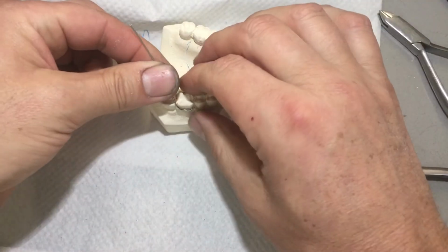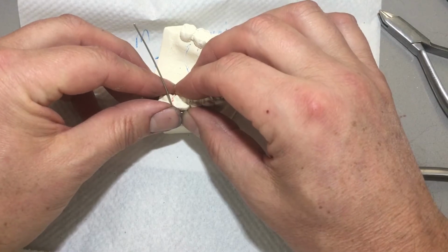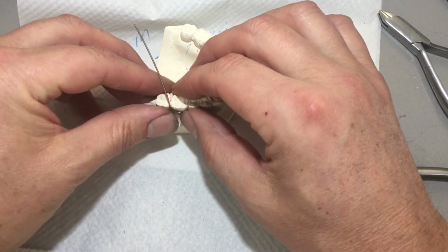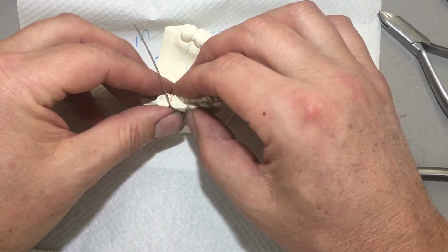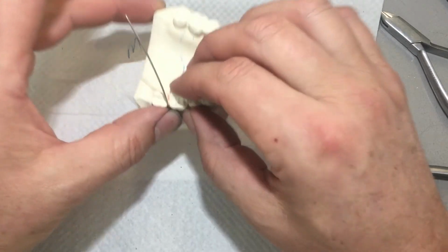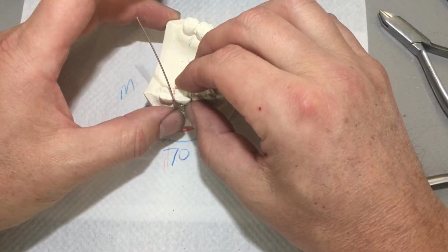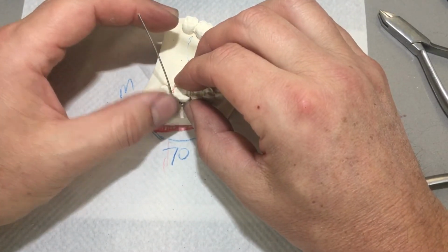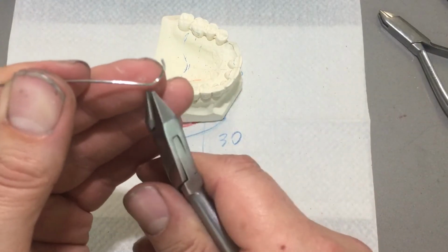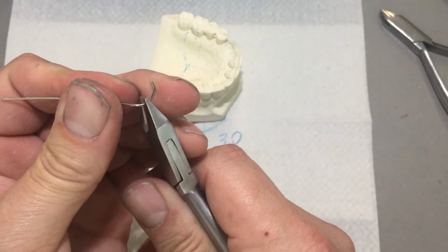and dedicate, no, the right word would be commit. I got to make a commitment that this is where I'm going to bend the wire. I got to make a commitment that this is the right place. And sometimes people have a hard time making a commitment. And why is that? Again, psychodynamics of dental technology.